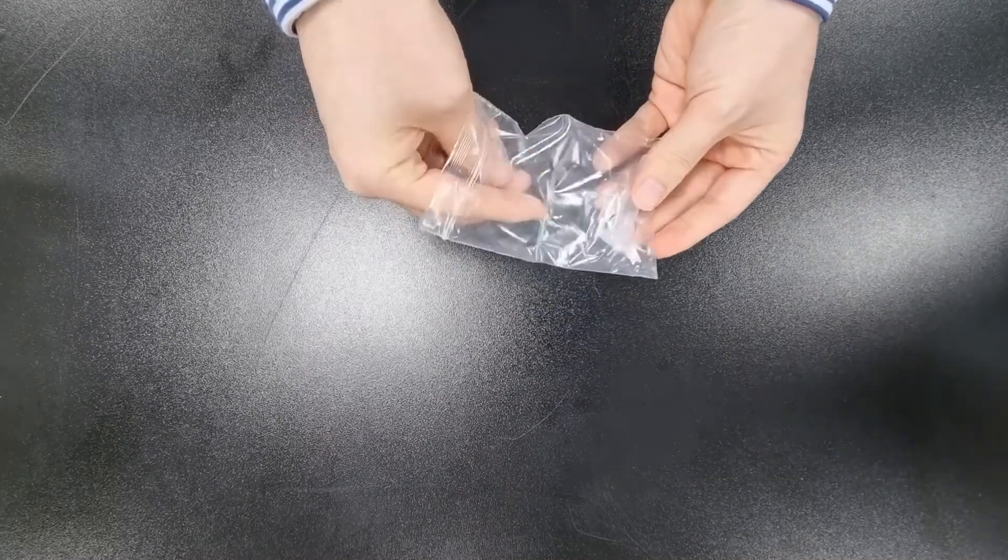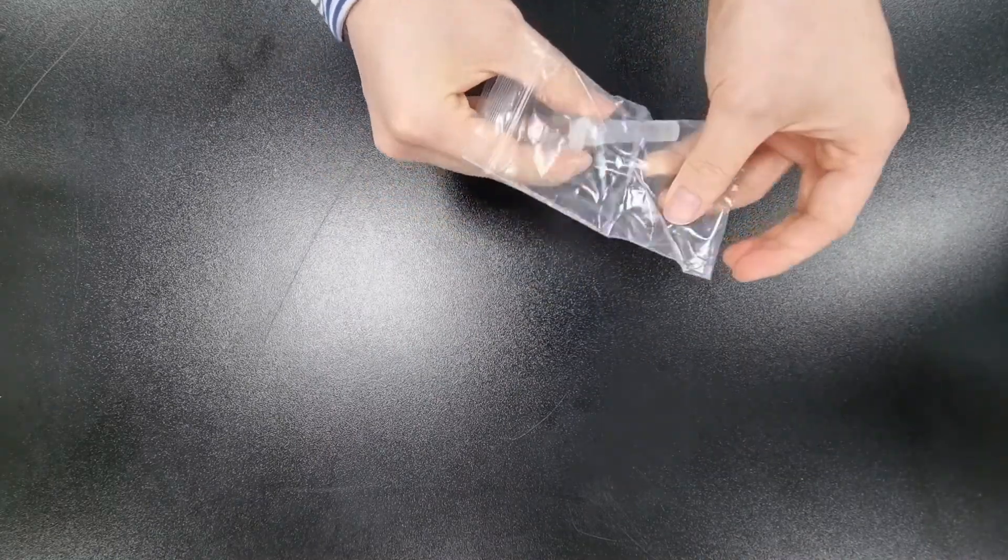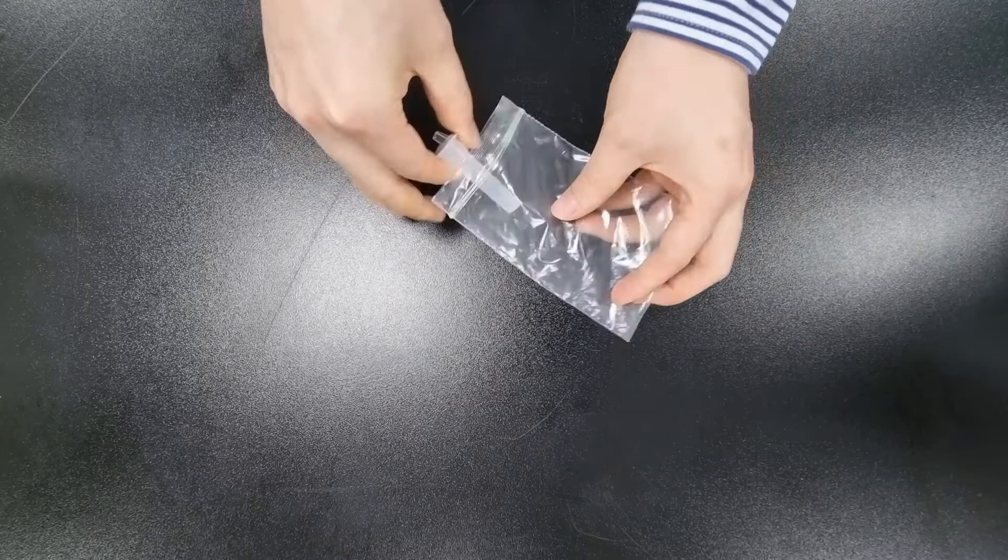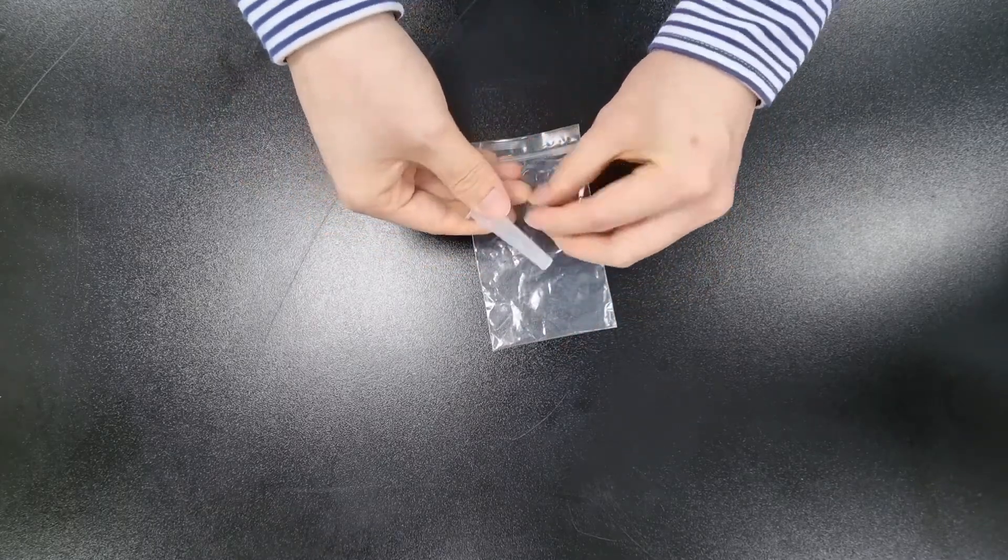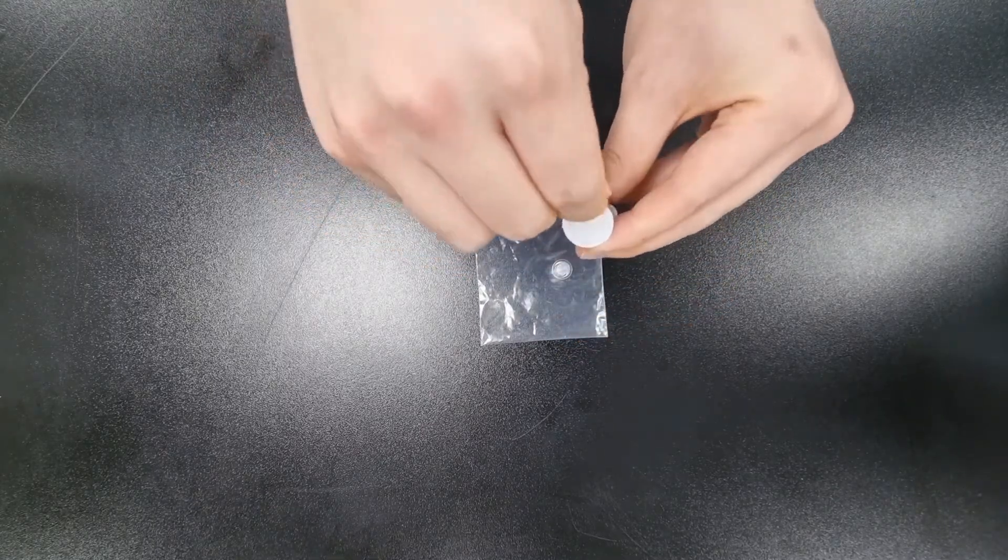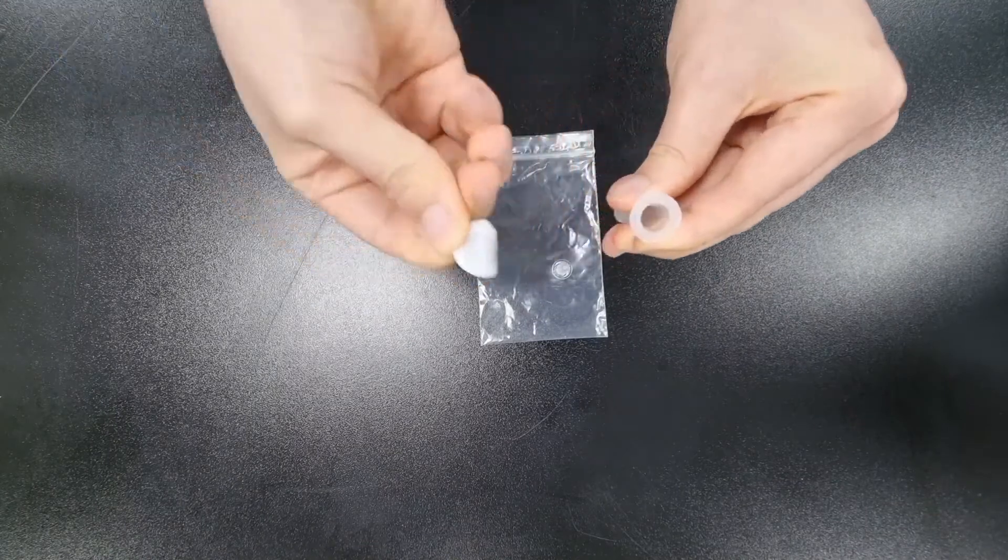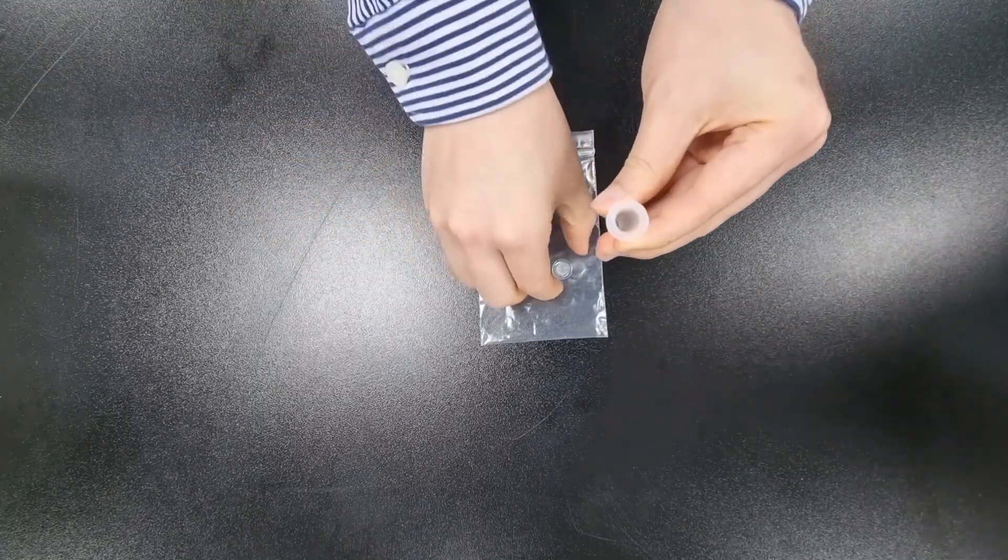Take out the sample diluent and drop cap from the zipper bag. Remove foil of sample diluent tube. Close sample diluent tube by dropper cap tightly.